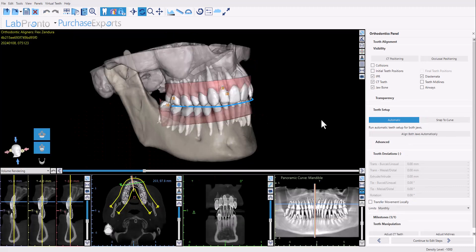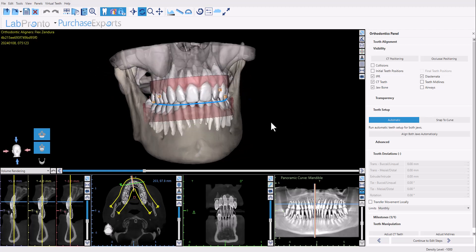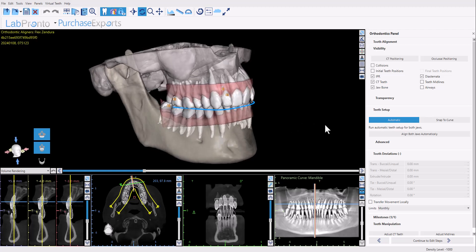In other training tutorials, I discuss the functionality that we have to be able to load a CT scan in addition to the optical scan when planning your aligner cases. This enables aligner planning based on true and full anatomical data and not based on simply crown-only information. Such root-based planning increases predictability and reduces those mid-course refinement cases.